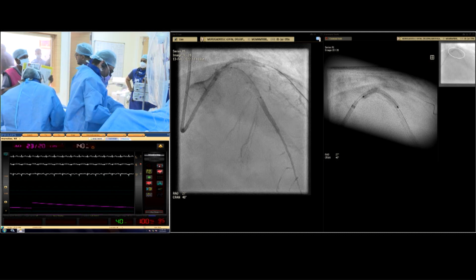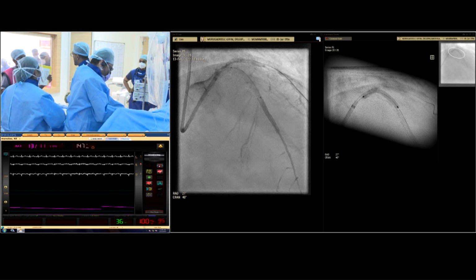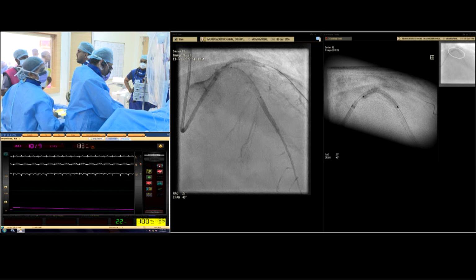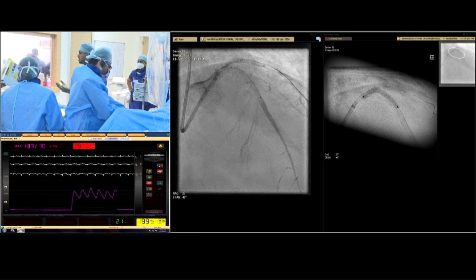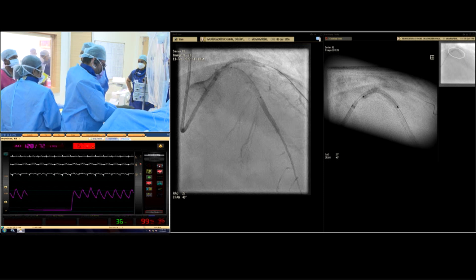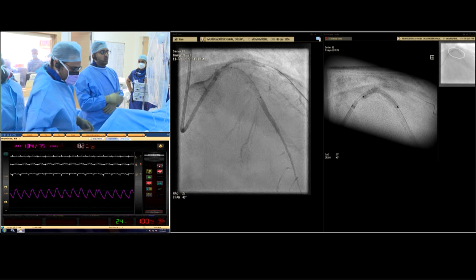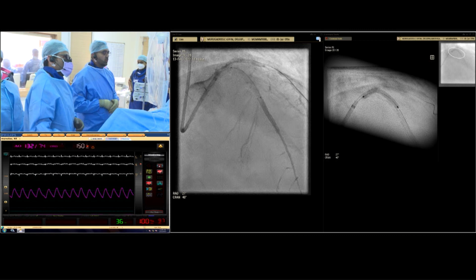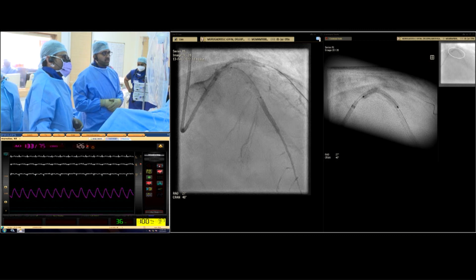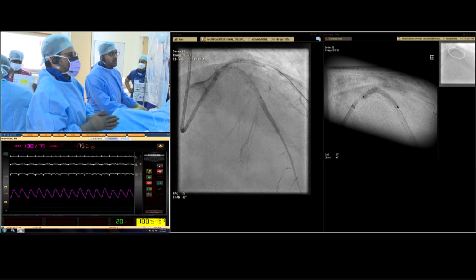Gopal, with that much work being done, what is the hesitation in covering up the ostium without any projection, or without projecting into the aorta, if you can do probably a lower rim cover? Sure. You just want to go up to at least one rim. So we'll put a 34. It's just that we're going to have a lot of overlap distally, and you can see one septal or diagonal has actually started to give slow flow. I'm just worried about the double layer. Do one OCT run for the exact length if you want to avoid all that. Otherwise, I think 34 is fine.